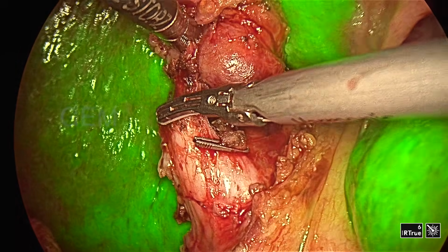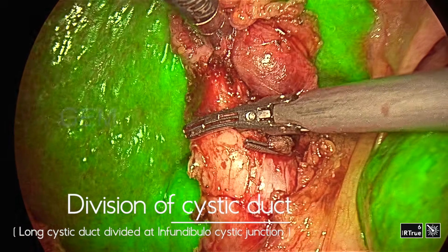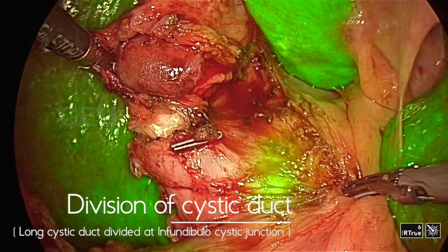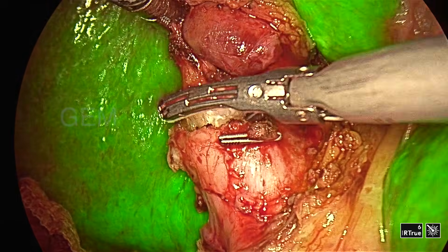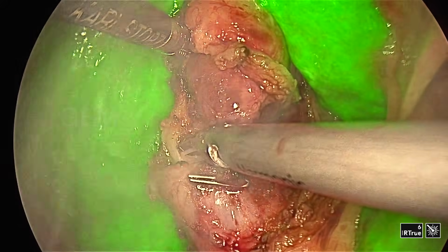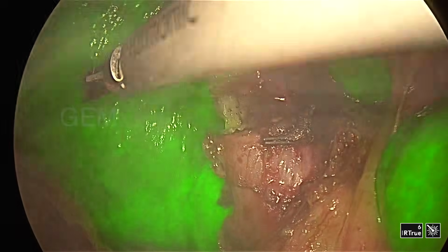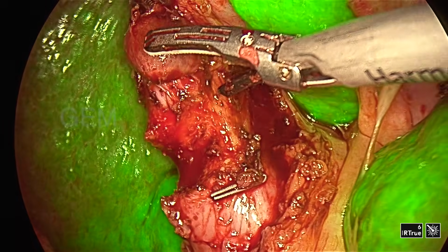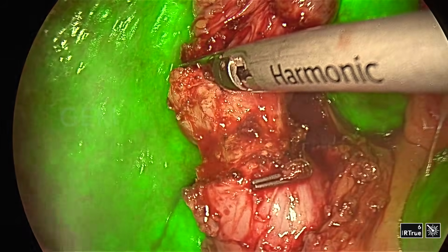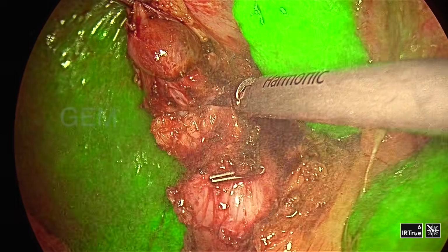You can see when I started division of the cystic duct, it is a long cystic duct. You can see the thickness. So I thought the stone is here only, that much thick is there. Initially I thought the stone is here. When I remove the stone, I will suture the duct, that was my plan, because by touching with the Maryland dissector, it's very hard. You can see the wall thickness, how thick the wall is. So finally I realized that okay, the MRI report is correct, because it is only the thick wall, not the stone.